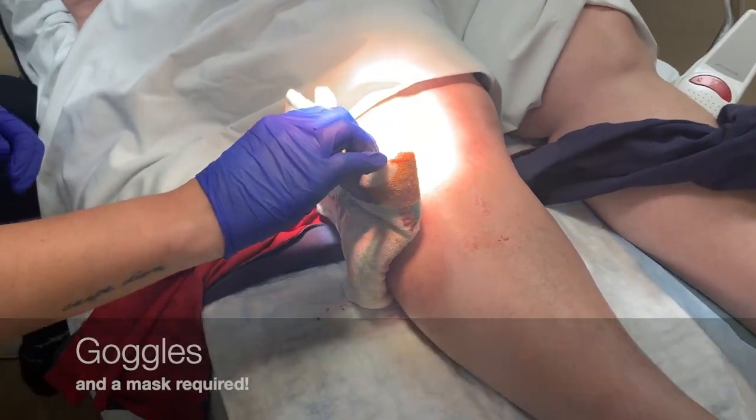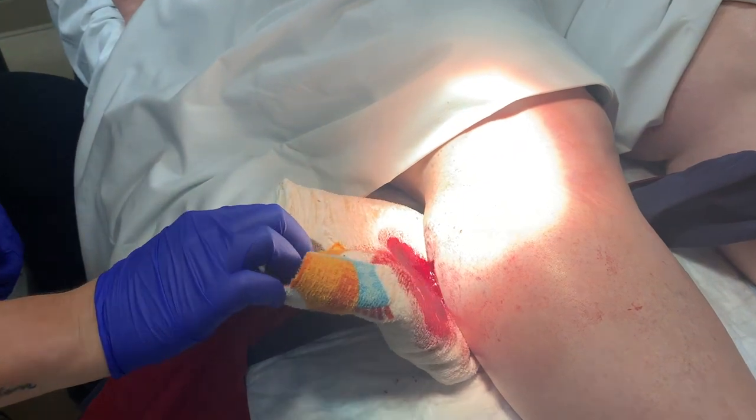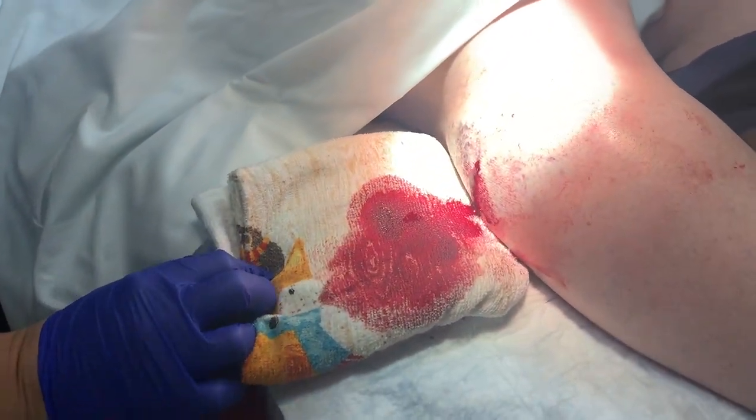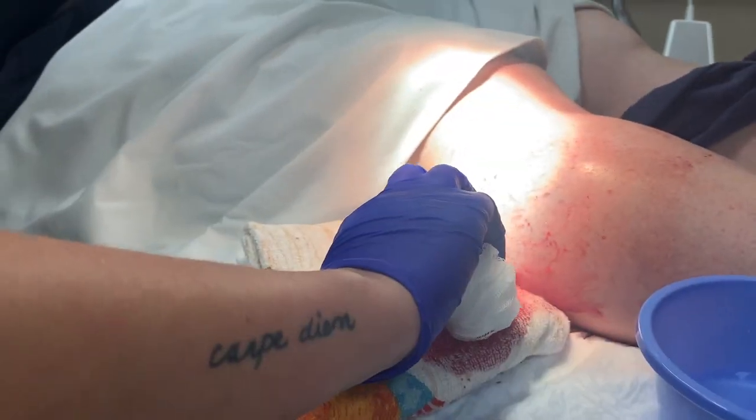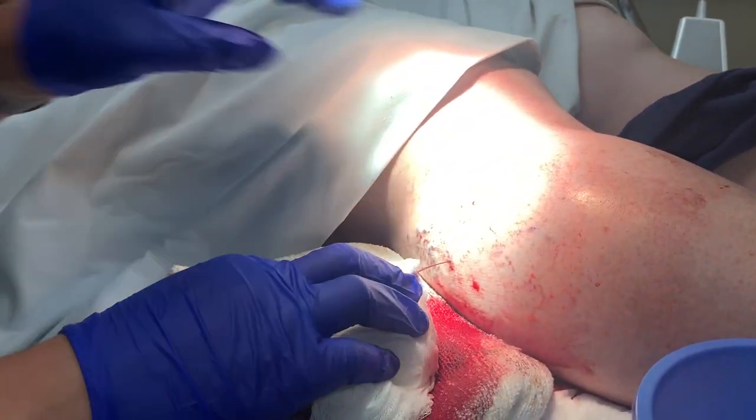As you can see here, she's bleeding quite a bit. I'm just going to take a little gauze here and clean her up. You can see we've got a good squirt here.